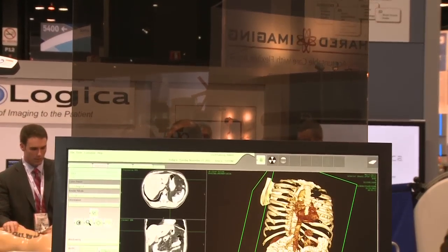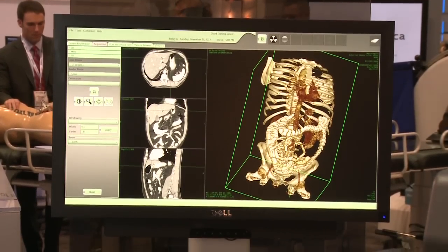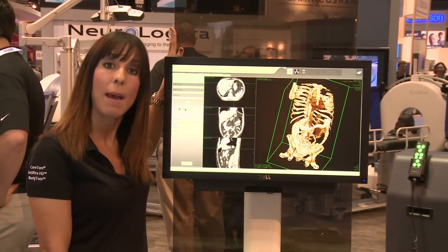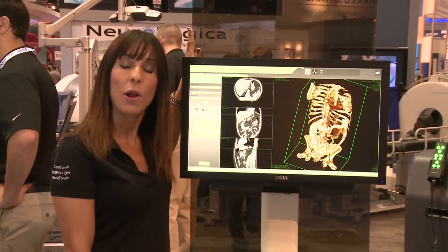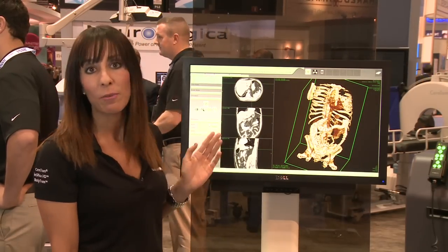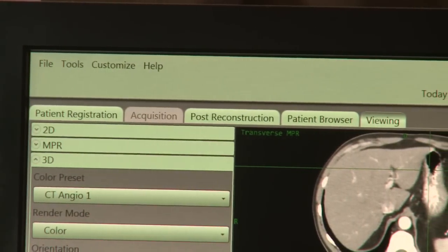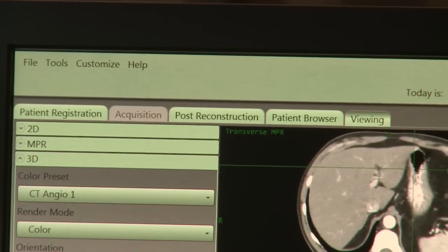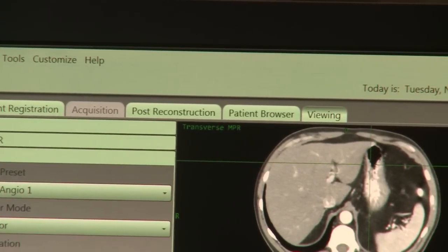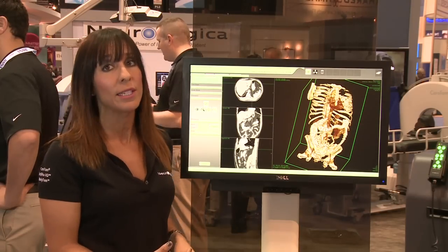This is our BodyTom scanner workstation. The first feature I want to point out is that we have an acrylic lead shield attached to it as an added safety measure for the technologist or operator, as well as for the OR staff when you're acquiring images during a case in the operating room. We kept the software really simple, and using this series of tabs at the top of the screen, the scanner operator can register a patient, select the scan technique, view the images, as well as do any additional reformatting or post-processing before sending the images wirelessly to PACS.